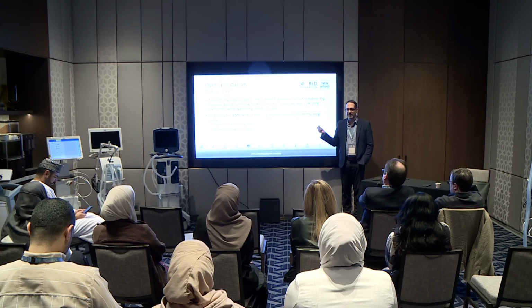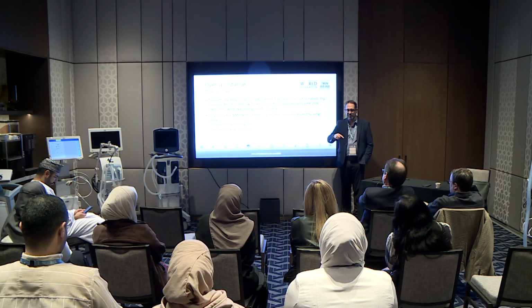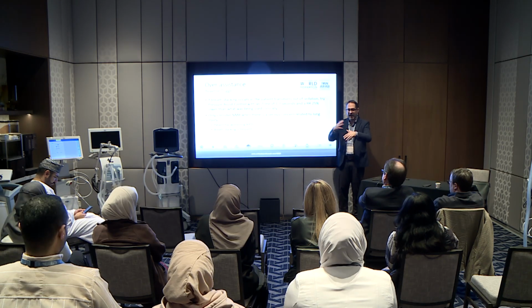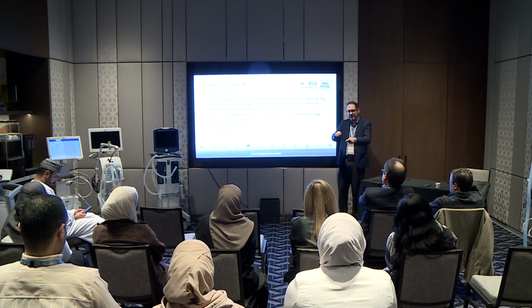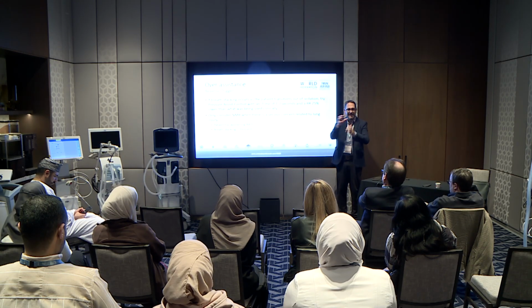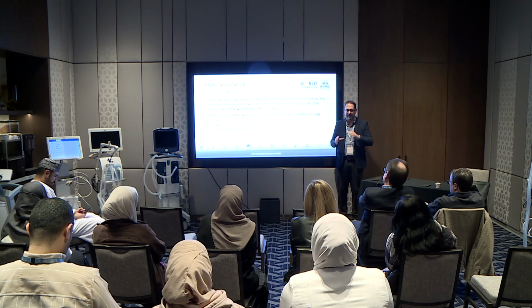So if someone's doing reverse triggering as you're weaning sedation, it's telling you that they're now interacting with the ventilator. We sometimes think this is a bad thing, but it's actually not. They're telling you that I'm interacting. So we can try to manipulate the ventilator to make that interaction more successful, but sedating them is not the answer. Very rarely would you sedate a patient.